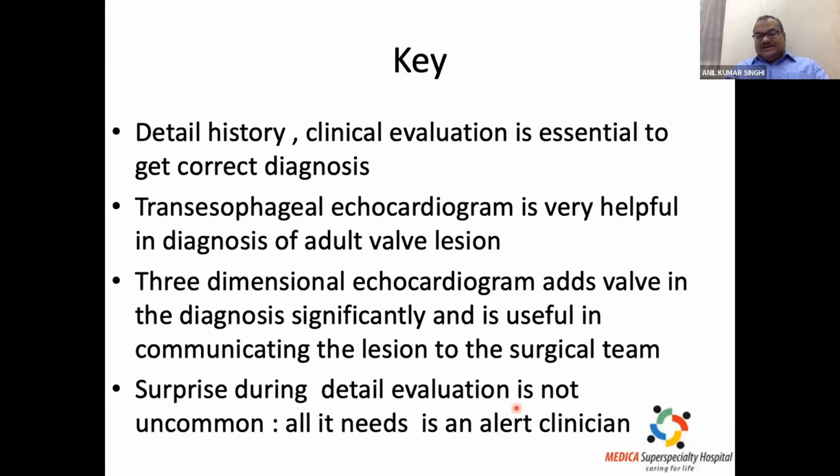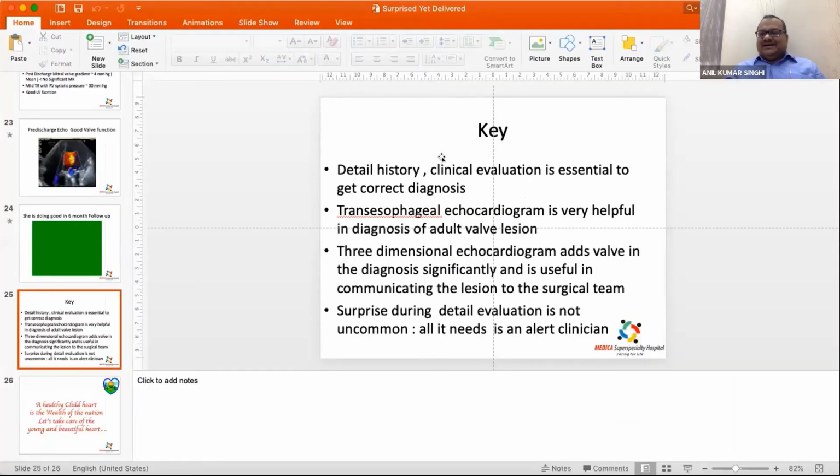And thank you. I just wish to share this case with Dr. Singh, just to give an input regarding how imaging is helping in a particular case, convincing my surgeons, and the augmented role from 2D transthoracic to 2D transesophageal to 3D transesophageal.